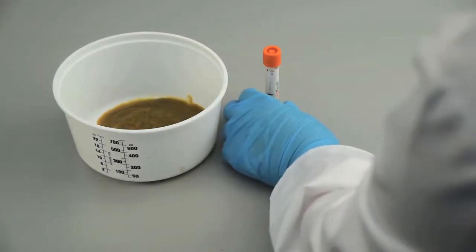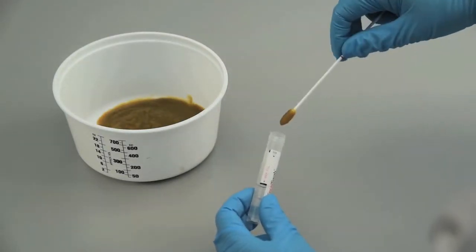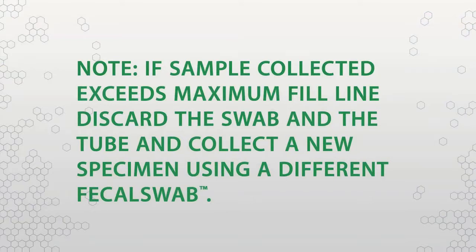After collection, transfer the swab into the fecal swab tube and check that the maximum filling line, max fill, on the label is not exceeded. Note, if sample collected exceeds maximum fill line, discard the swab in the tube and collect a new specimen using a different fecal swab.